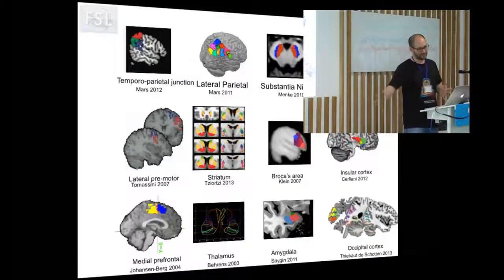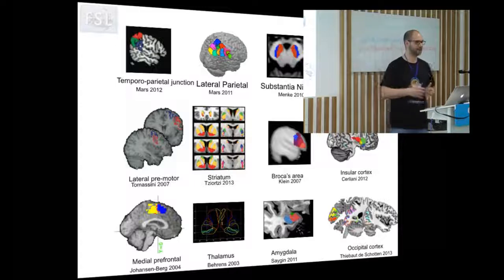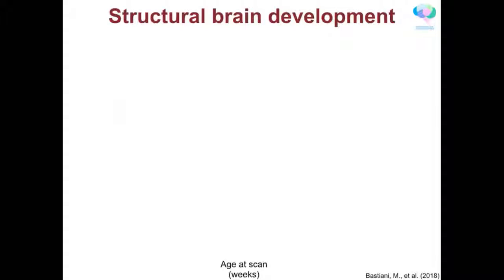And of course, this has been taken and expanded to parcellate different cortical areas and different subcortical structures in other studies quite successfully, while comparing to prior anatomical knowledge or between different species to try to look for homologous areas and regions.